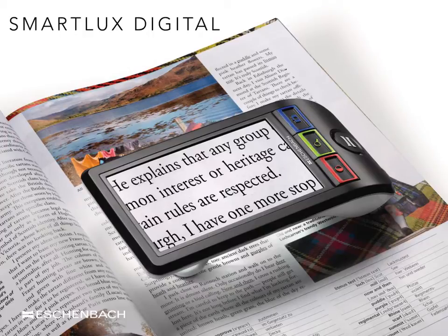In the picture, a high quality image is produced in full colour mode and is displaying five times magnification on a non-reflective 5-inch liquid crystal display screen. The SmartLux Digital offers a larger than average range of magnification compared to similar products, offering up to 12 times magnification.